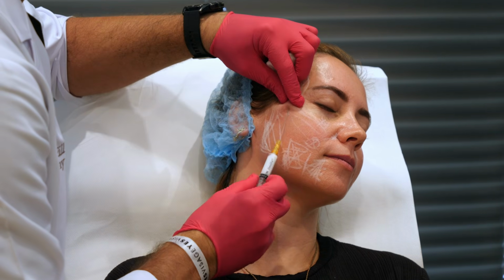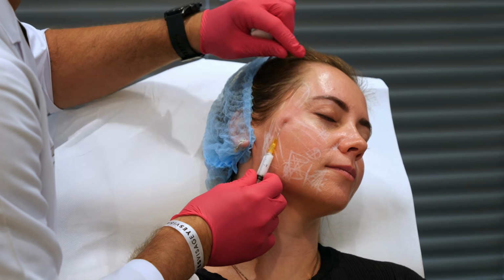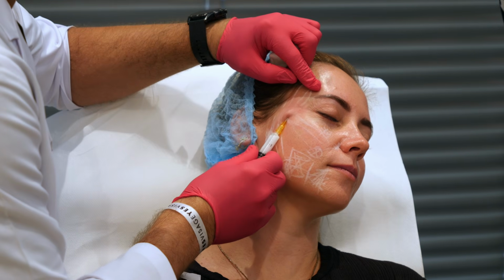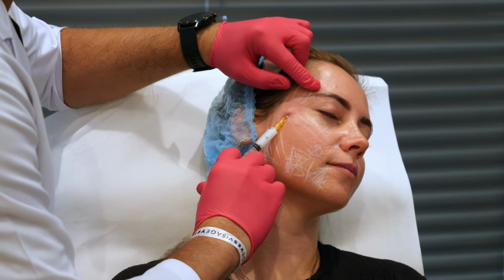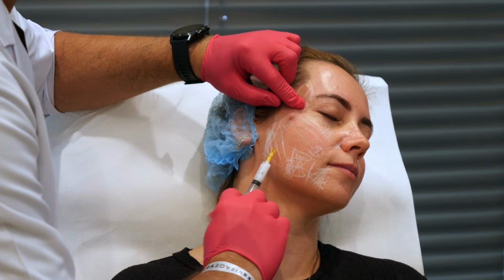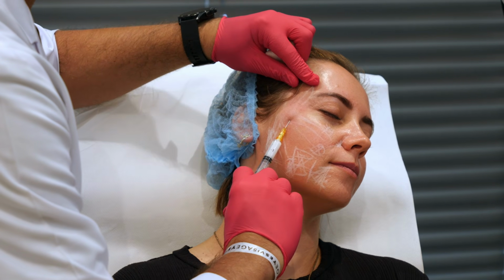subcutaneous. Here, go slow. You can see the tip of the cannula and go to the frontal limits, okay? You can see it's a good treatment for the temple, okay? Smooth. Another vector.